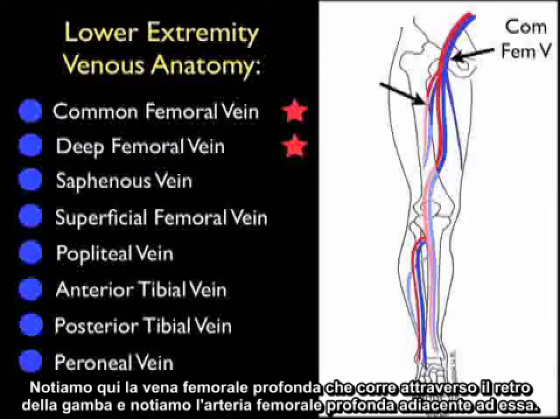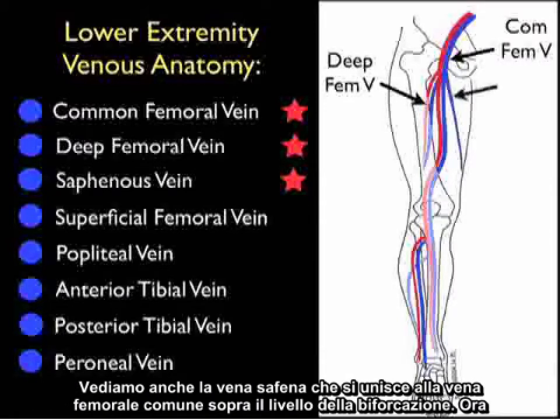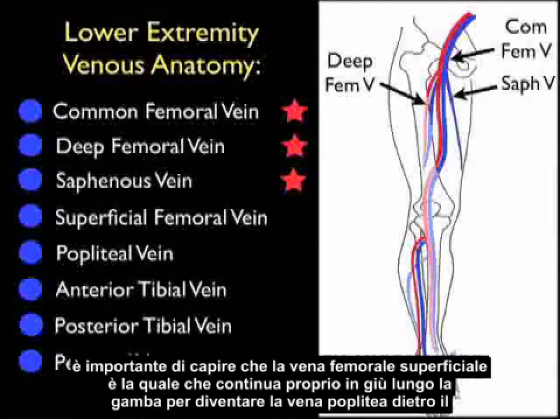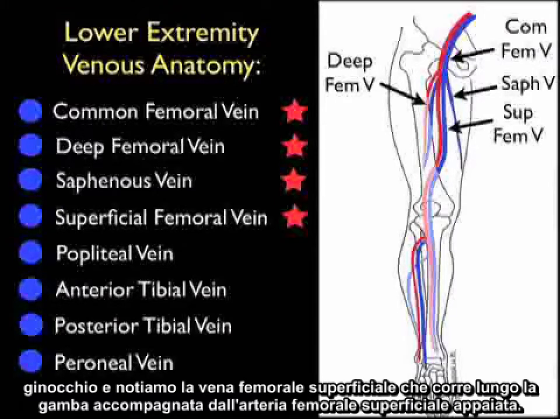We note here the deep femoral vein coursing to the back of the leg and the adjacent deep femoral artery. We also see here the saphenous vein which joins into the common femoral vein above the level of bifurcation. It's important to realize that the superficial femoral vein is the vein that actually continues down the leg to become the popliteal vein behind the knee, accompanied by the paired superficial femoral artery.